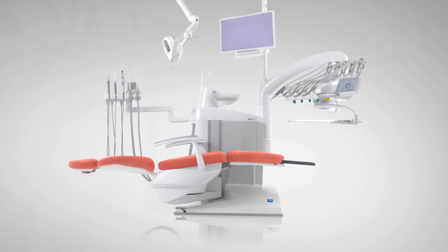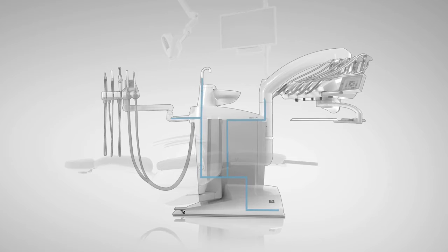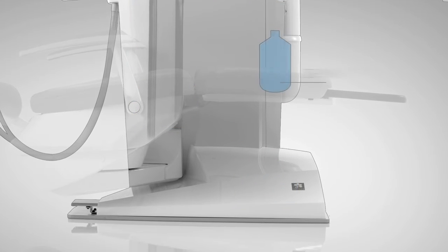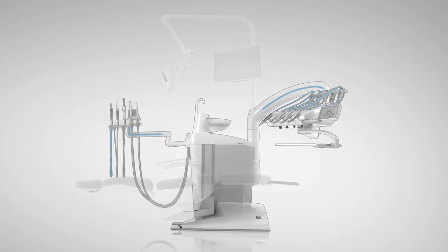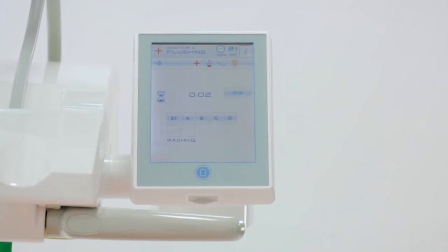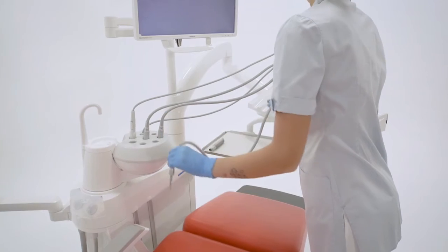The IW FC device performs a quick and automated cleaning cycle of the entire water circuit of the dental unit by using mains water, WHE, or liquid from the independent supply tank. At the end of the cycle, the suction flow stops and the message prompting to put the instruments back in place is displayed.